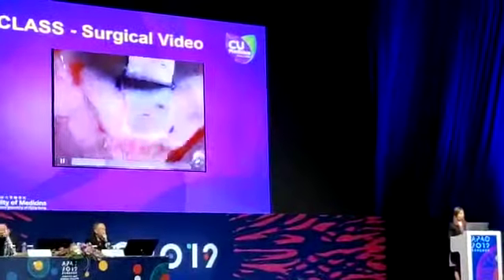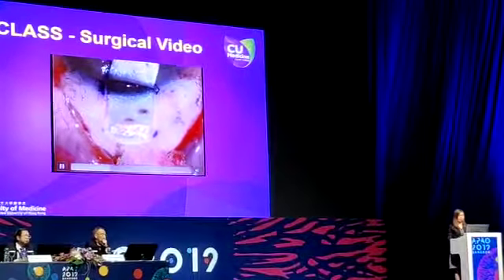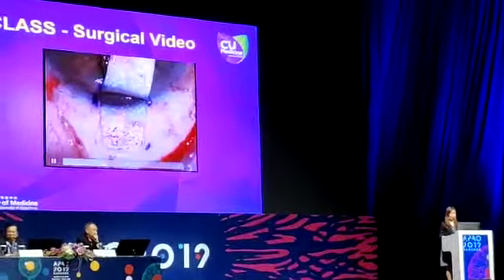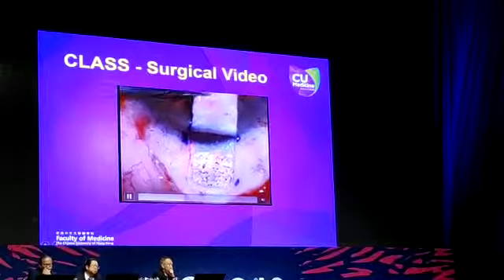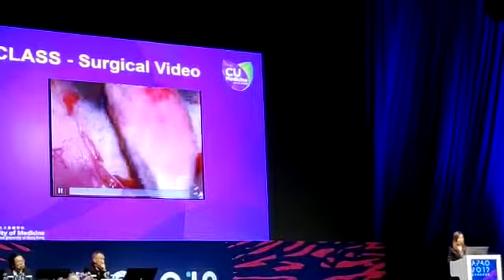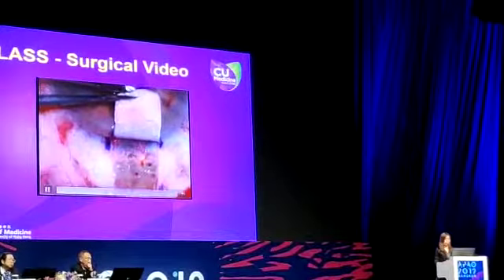And similar to trabeculectomy, we have to apply anti-fibrotic agents, usually mitomycin C 0.04% in our locality, for about a few minutes. And afterwards, you can start applying the laser onto the scleral bed, which is the white zone. This is supposed to be a scleral lake to accumulate the aqueous after the aqueous percolation from the gray zone. And so the depth of the first ablation can be titrated, and so you can apply just a layer so as to accumulate the fluid.